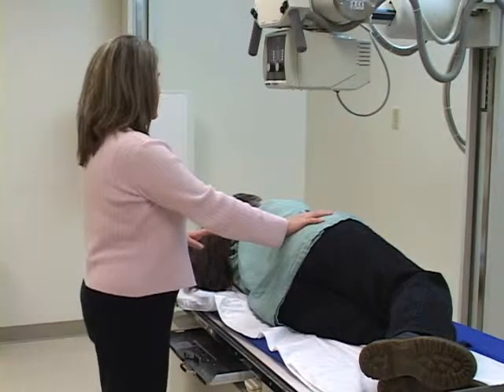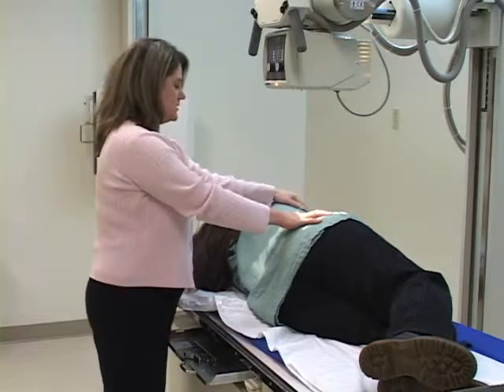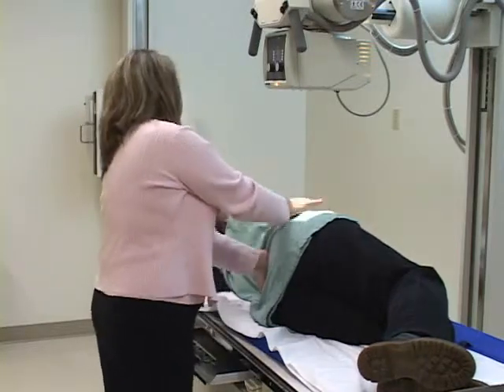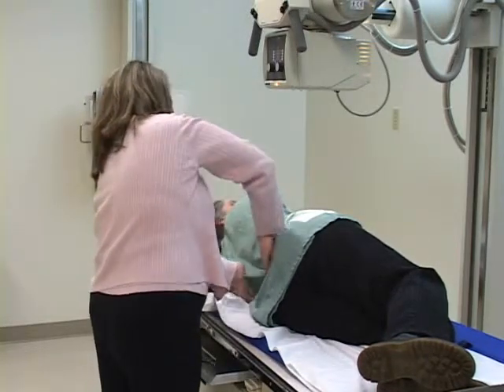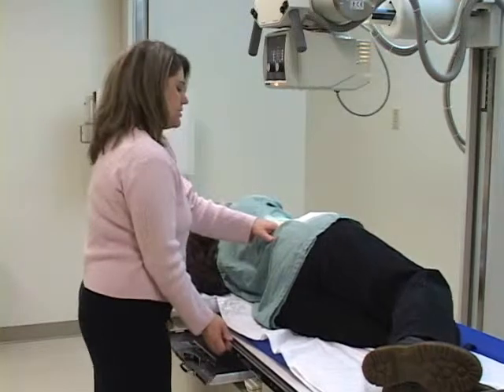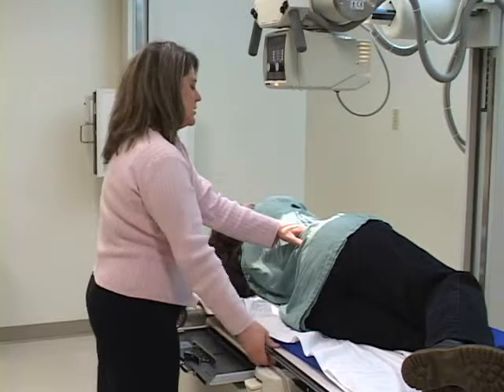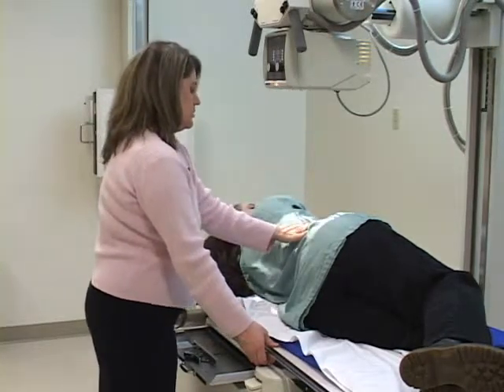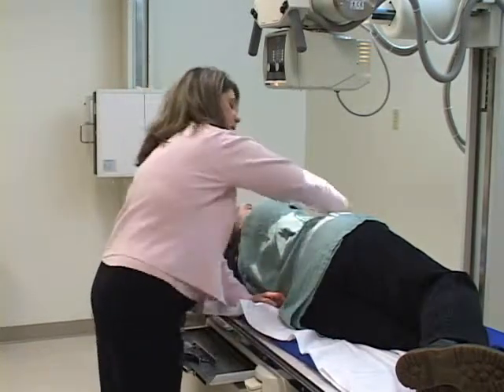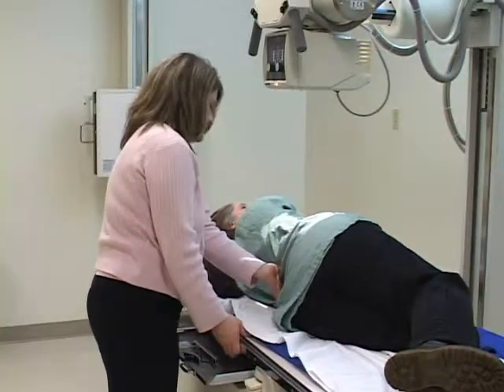Okay, Heidi, we're going to do a lateral abdomen now. So most of the time you're going to be up on your left side because that's typically the routine that is done everywhere. Okay, so I'm going to rotate you up because I want you to be as flat and as even as I can right there. Okay, you're going to position the patient about 2 inches above the top of the iliac crest. So this is just a little bit higher than your traditional KUB or your prone. Okay, and again, you're mainly interested in the anterior portion of the patient, so make sure you don't cut off anything in the front.